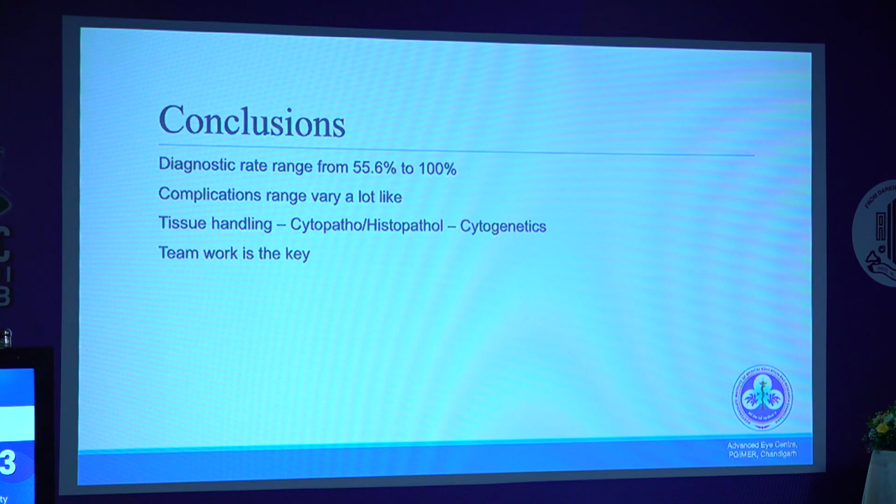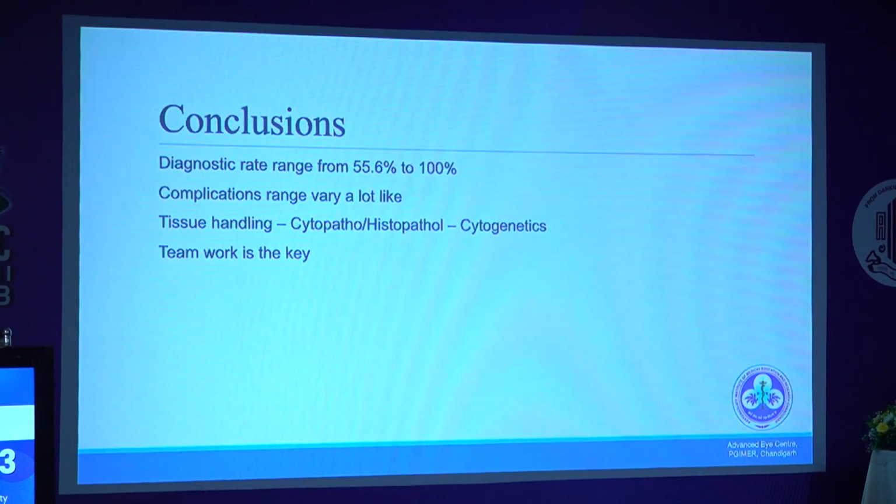But yes, in uveitis we use ultra wide angiography and the ultra wide fundus photography a lot. So that is a different thing. But here, I think just better documentation is more important.